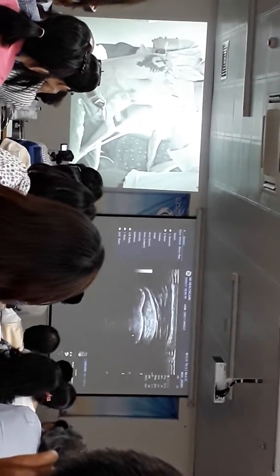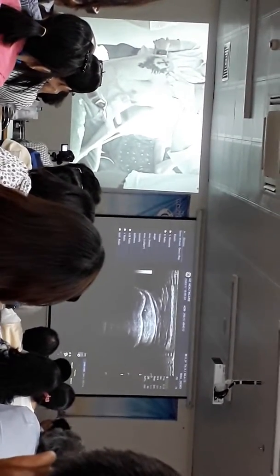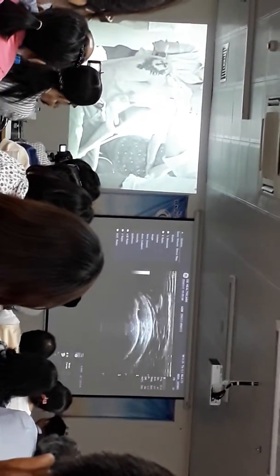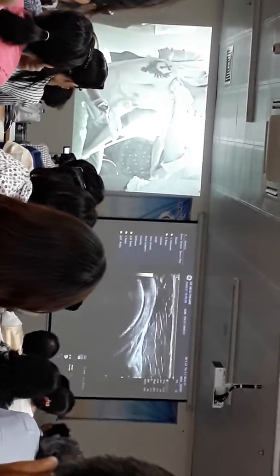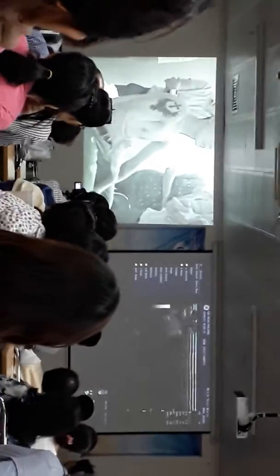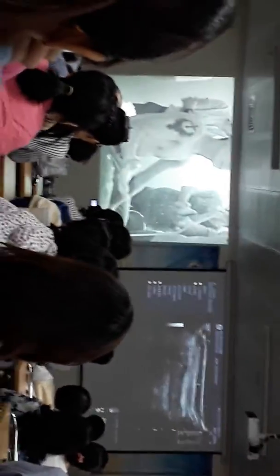And then we come all the way across and we're able to see the footprint of the subscapularis just here, at its attachment on the lesser tuberosity. From there, I'll move on and have a look at the supraspinatus tendon.